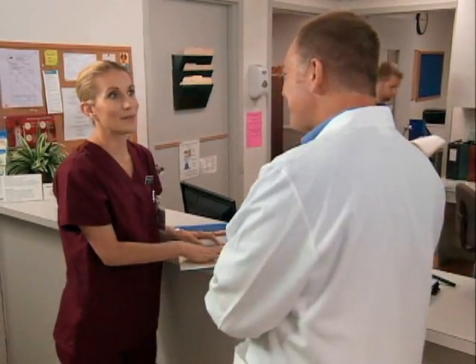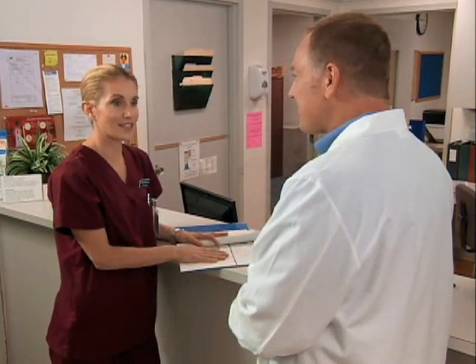Mr. McDaniel, my patient has a tracheostomy, and I think site care is done daily. Is that right? Yes, usually daily or more often as needed. Well, we reviewed trach care and practiced in the skills lab, but I've only taken care of one patient with a tracheostomy before. Can you help me? Of course, Marissa. I'd be happy to help you.